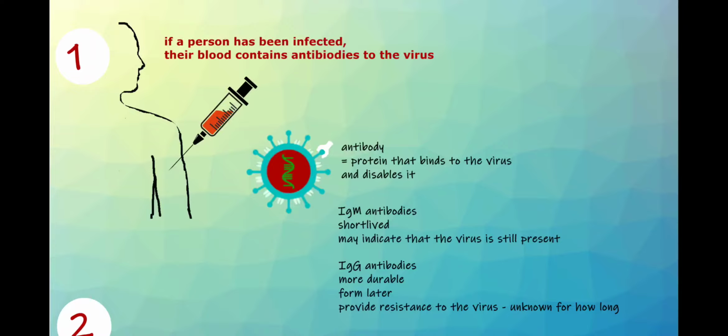Before that, we have to concentrate on two kinds of antibodies. They are IgM and IgG. Actually, we have 5 kinds of antibodies, but in this video we are only going to concentrate on two, because in the case of infection, the immediate response is provided by these two antibodies only, friends. First of all, we have to know the difference between IgM and IgG.